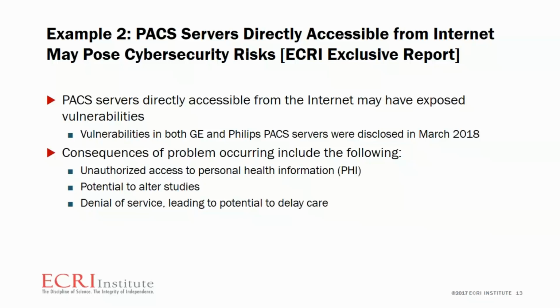Some of these include unauthorized access to PHI, potential to alter studies, and most importantly, really the denial of service. If you suddenly don't have access to your PACS server, this has the potential to delay care.